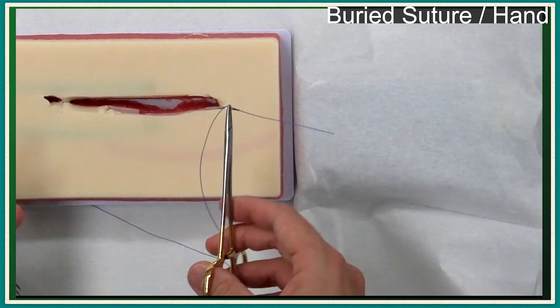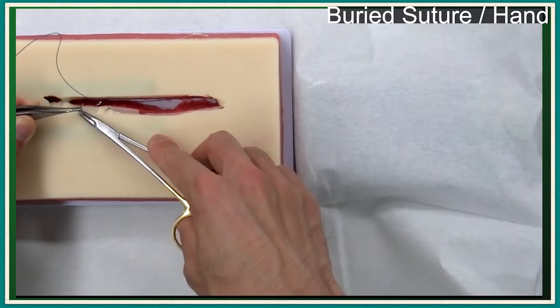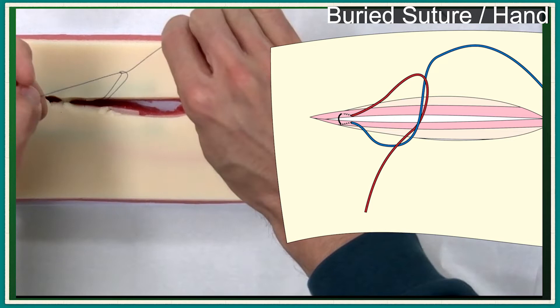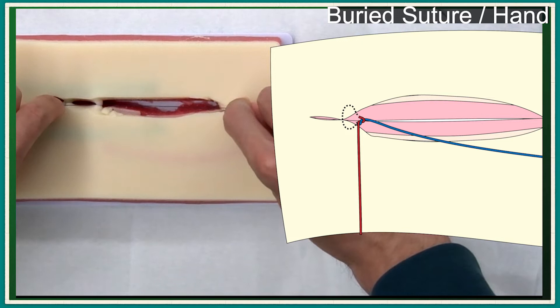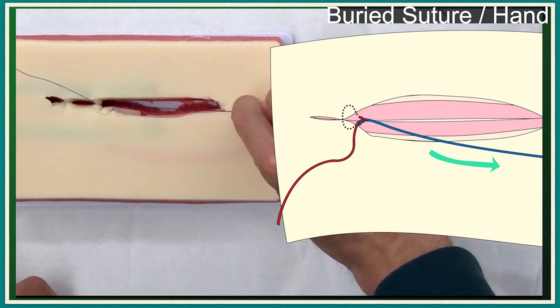The next part is buried suture. The surgeon is right-handed. Start the skin closure from the left side. Put the suture under the skin. The first knot is formed by a one-handed knot. Pull the suture parallel to the wound and increase the suture tension. After you set the tension, by pulling the right hand end toward the outside continuously, you can hold the tension by friction and release the left hand. If you pull the suture end too strongly, the suture will slip through the skin.